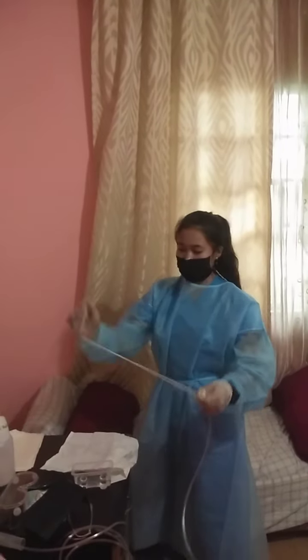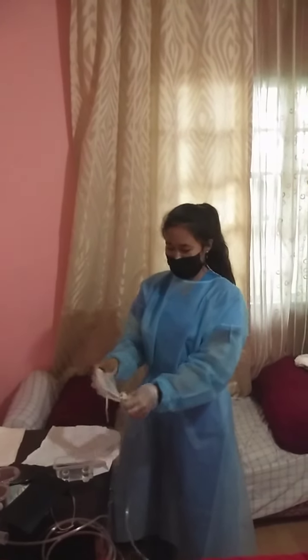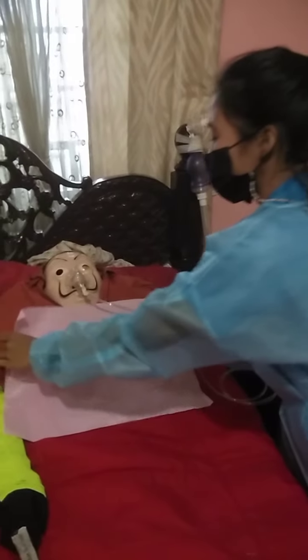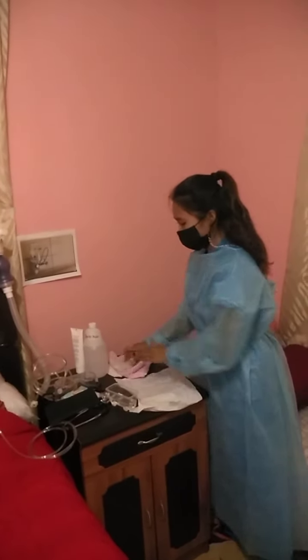So, when you finish the suctioning, detach the suction catheter. Remove the gloves. Dispose of all supplies in the receptacle. So, don't forget to wash your hands. And for the documentation, I will document the procedure and related assessment findings, report, and any concerns according to agency policy.